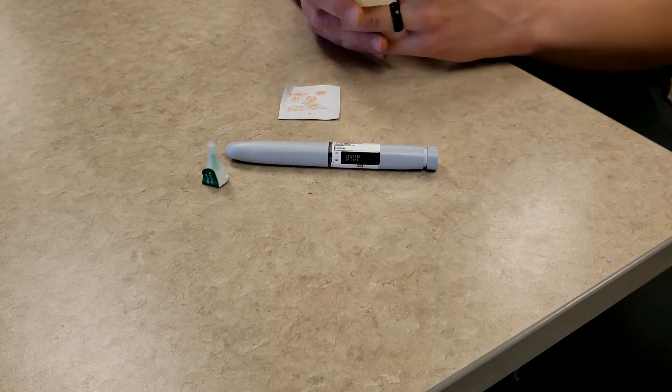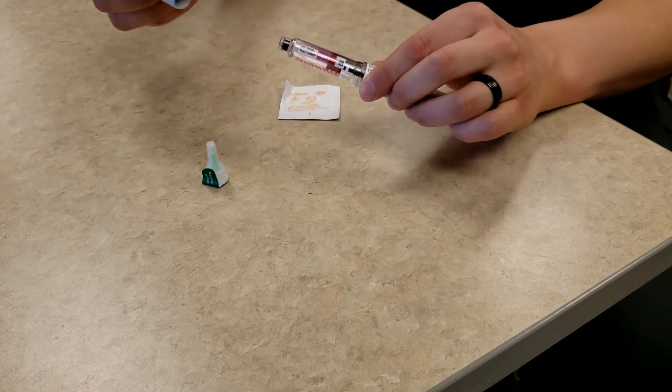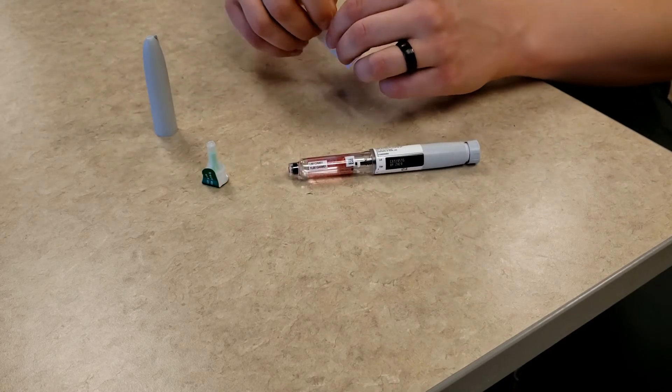The first step is to remove the cap from the insulin pen and use your alcohol wipe to clean the rubber stopper on the end of the pen.